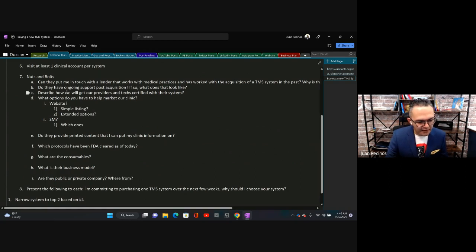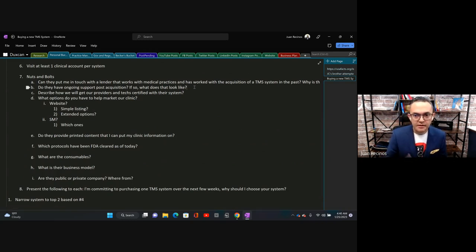All right, do they have ongoing support post-acquisition? If so, what does it look like? What does that mean? What's their training program? What's it look like in terms of coming on site and working with your marketing department, your data analytics department, your various departments, your TMS techs, and your TMS providers? What does it look like specifically? And does the clinical account that we went and visited sustain and support it, like say, yeah, they do what they say they're going to do? Not all of them do.